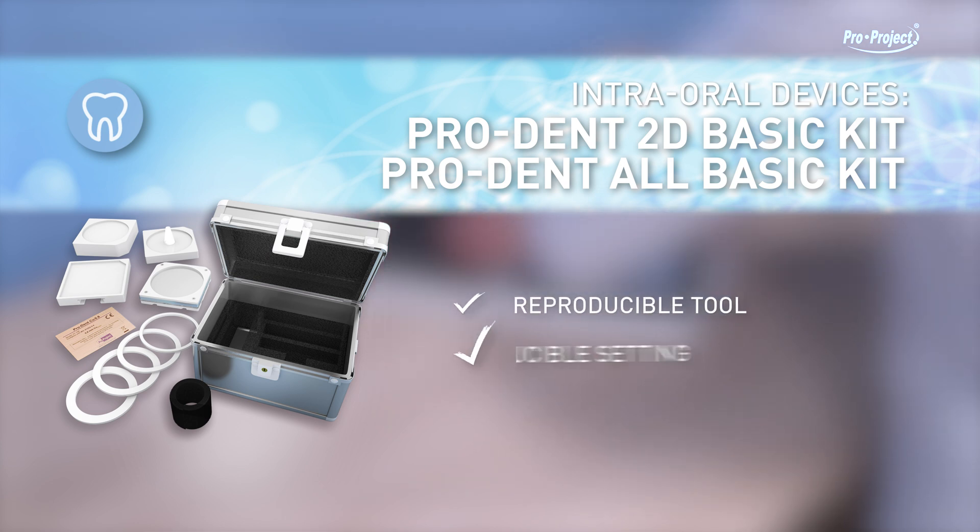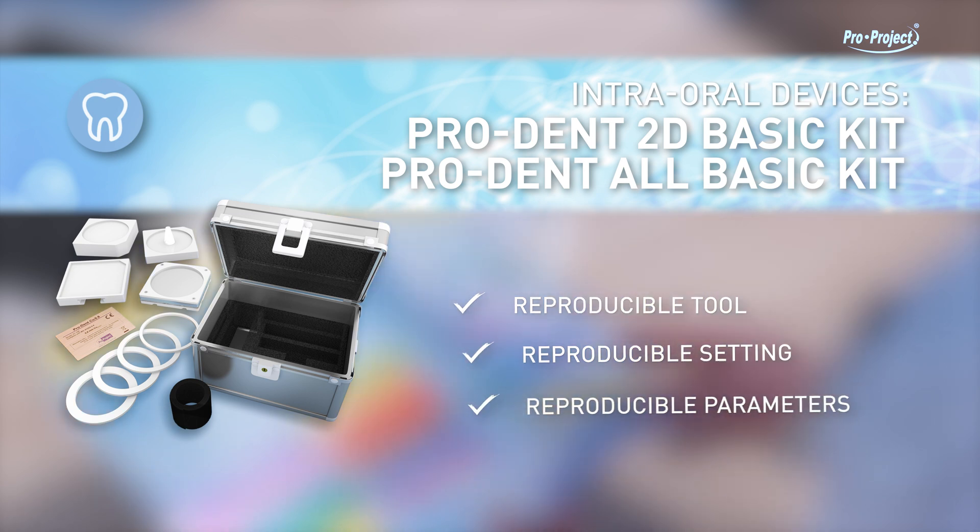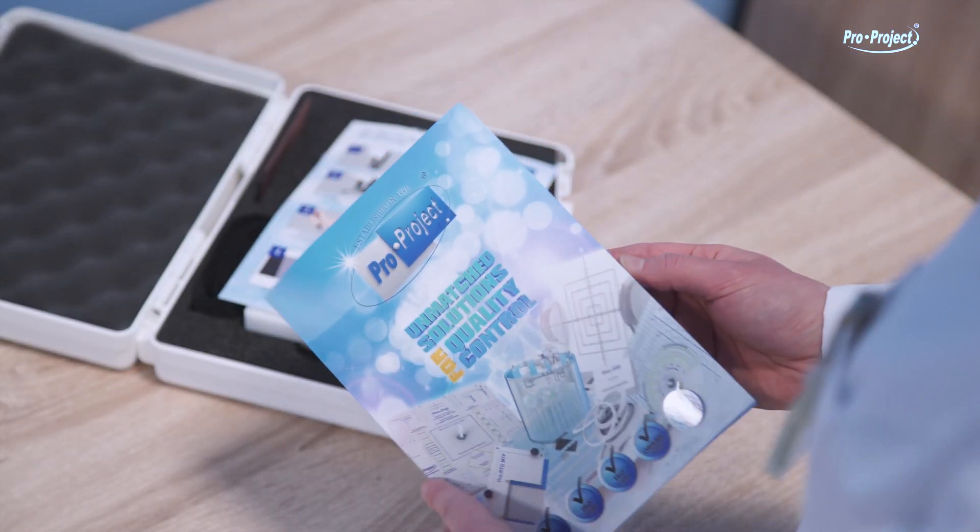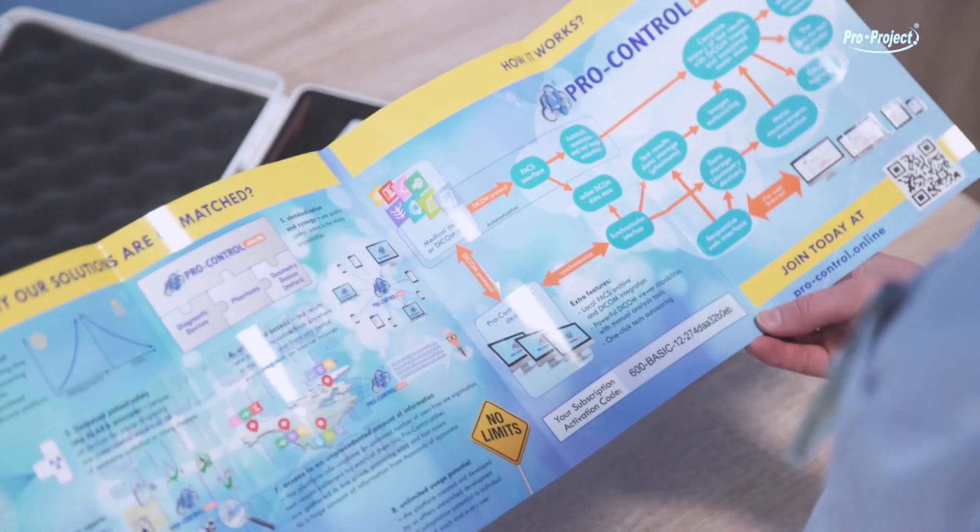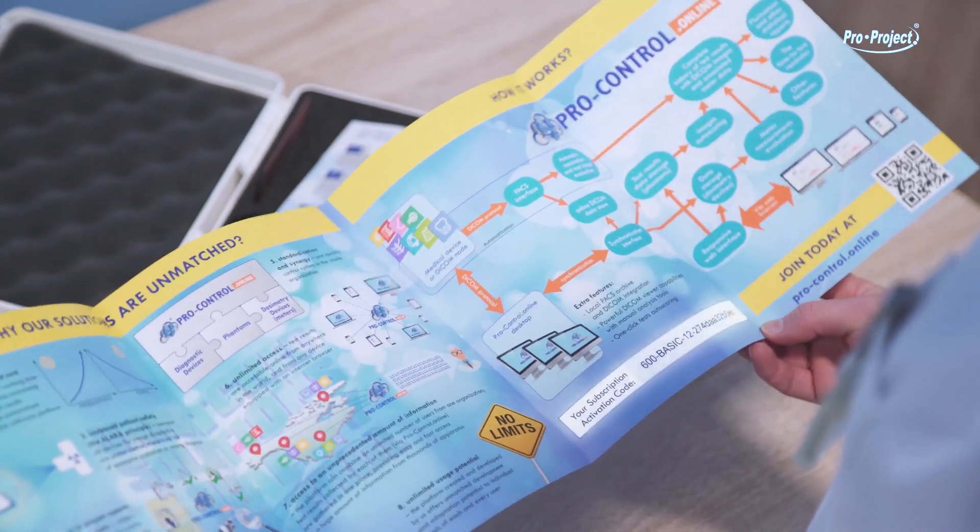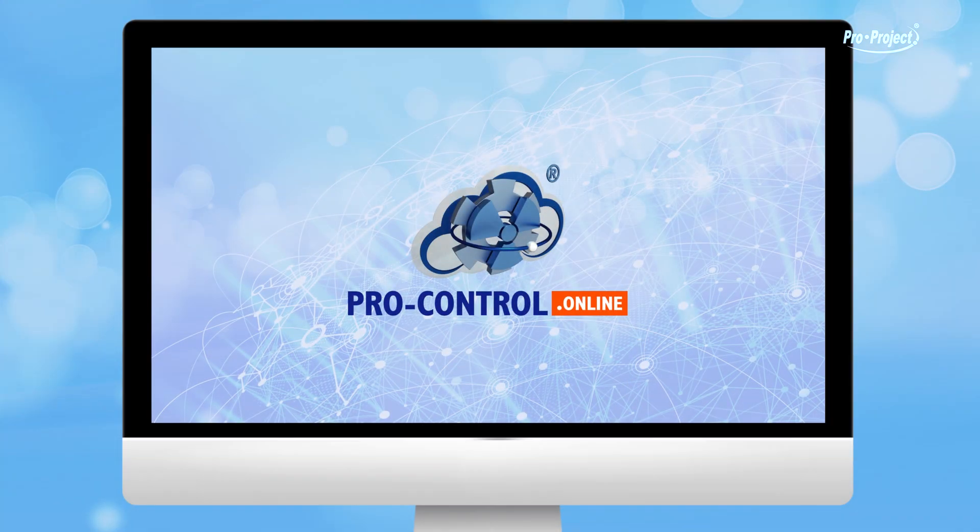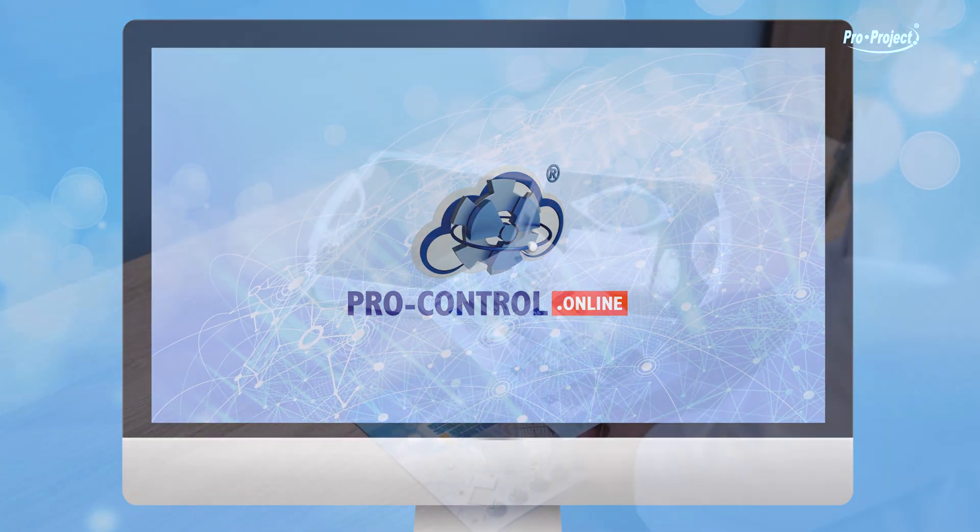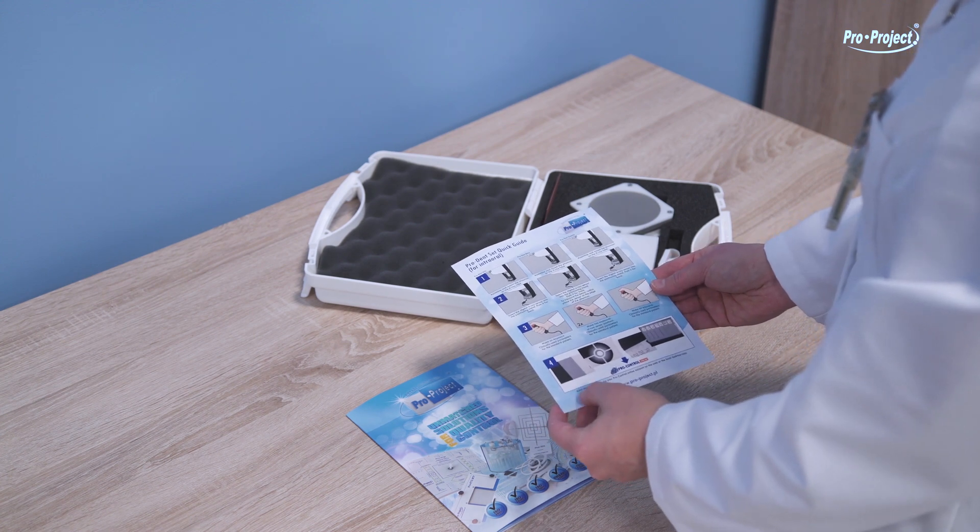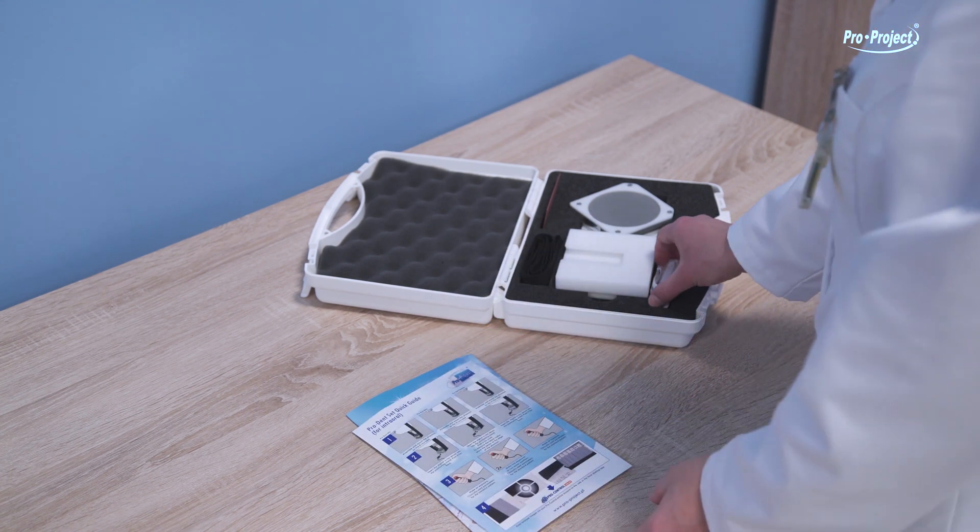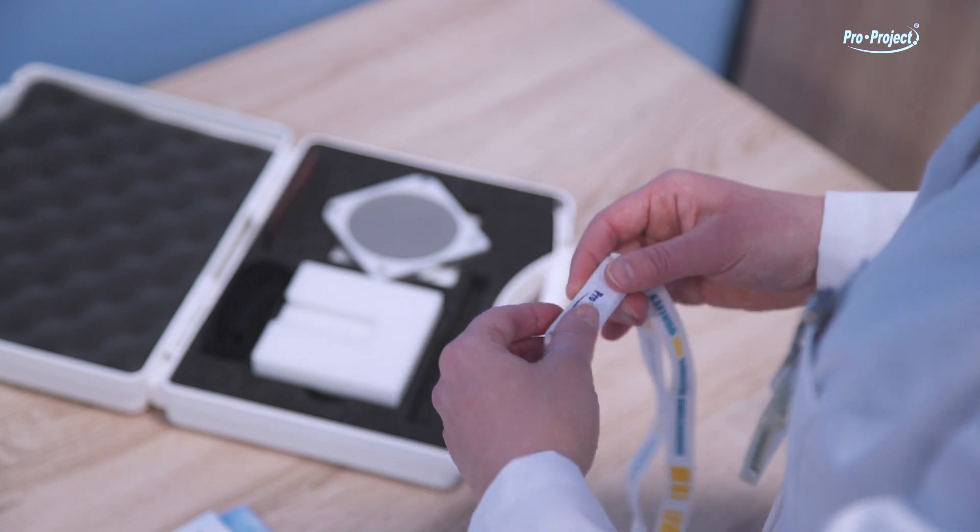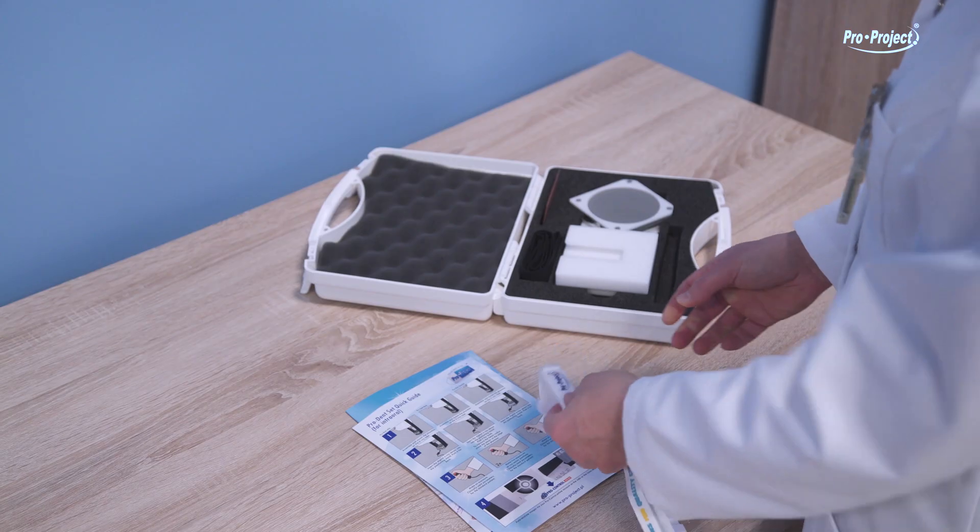The kit contains ProControl Online automation software, leaflet with the subscription activation code to create your own account. Go to ProControl Online website. Abridged manuals, manuals and documentation on a USB drive.